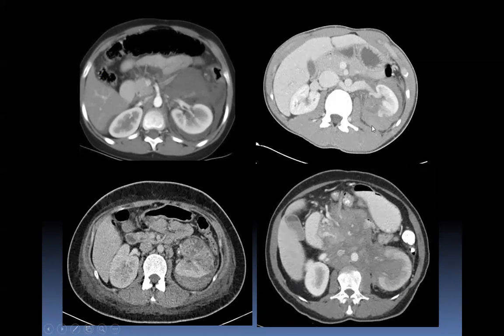Obviously, there would be some blood, with any trauma anywhere, you would have some mixture of blood. That is why I've said the 4th and 5th category ones are the ones where you have to be a little careful. Is he actively bleeding or not? Because hemodynamic status is the one which is going to define. Sometimes you have a leaky blood vessel which just sort of limits itself. So the vessel just blocks on its own. So you don't need to go in those cases. But if it's actively bleeding, then you need to go in and tie up that vessel.